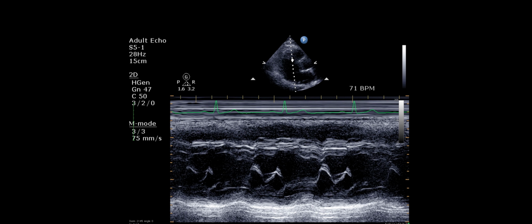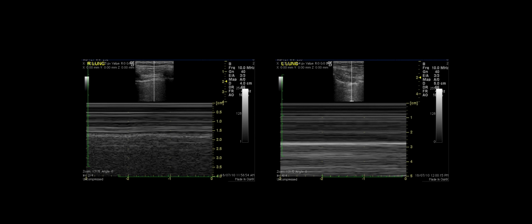And so you can see how the very, very rapid movement of that flickering mitral valve during atrial contractions and then the active relaxation of the ventricle, you can see different patterns of movement of that valve. Mostly we use it for patterns of movement, but it was used in the past when the ability to store large amounts of data was less so on ultrasounds.